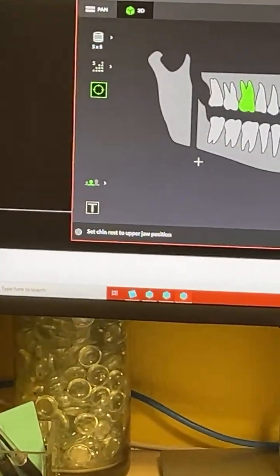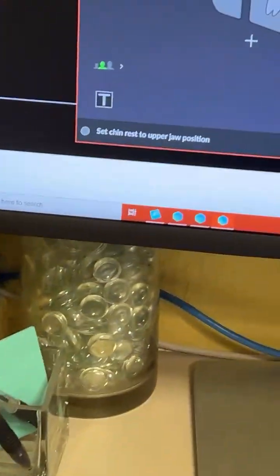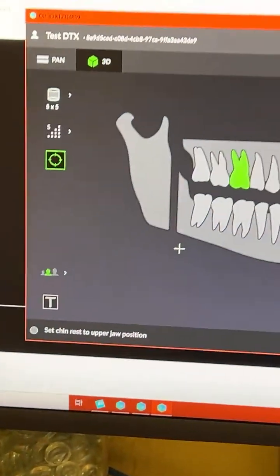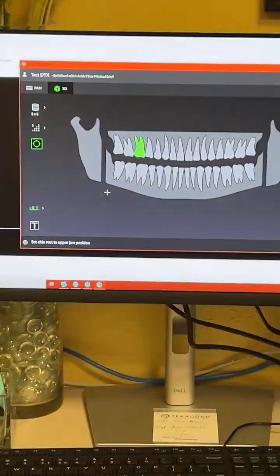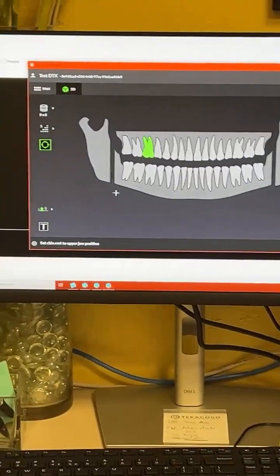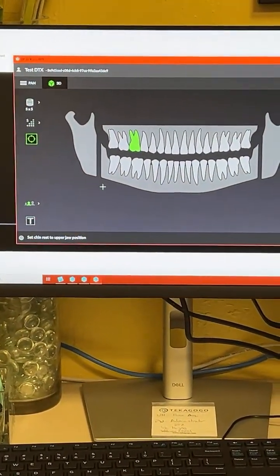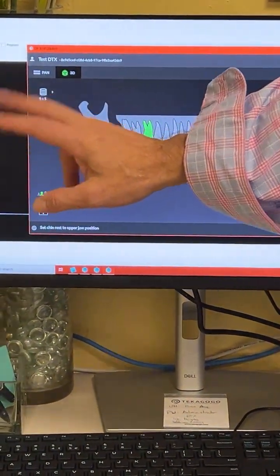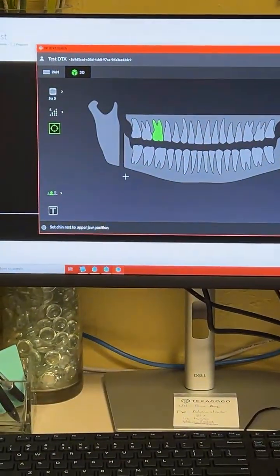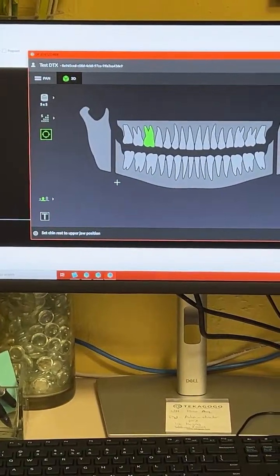So at first we go with default first, and then we try to pre-test, the scout shot. First we don't change anything, we go with the default of the machine. Then we do the pre-test, right? And then after that we look at it to see what we can adjust. But you do have to choose the resolution you want first. You can't choose unless you're an expert. But if we don't know, then we just go ahead with the default and then adjust later.